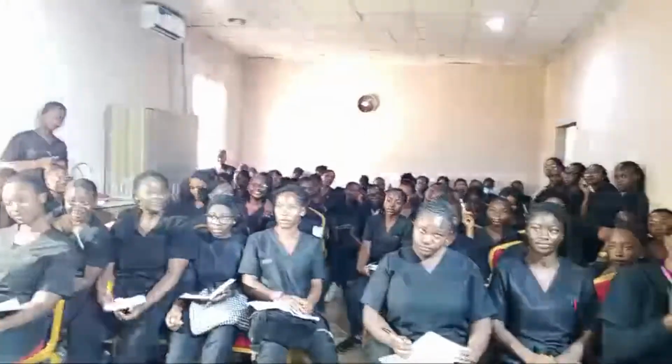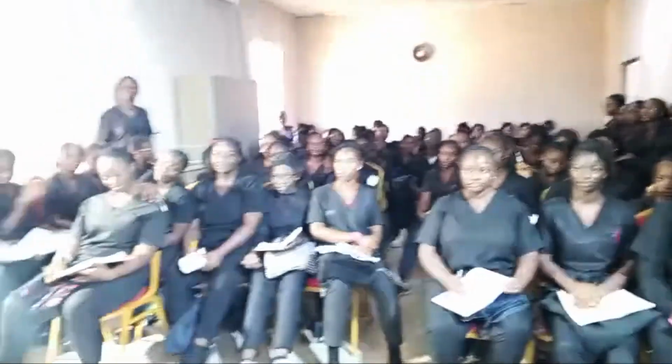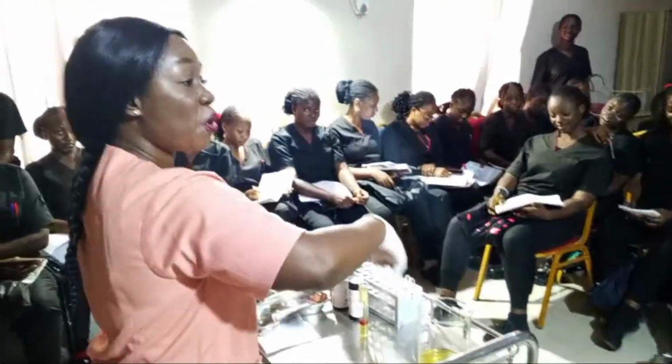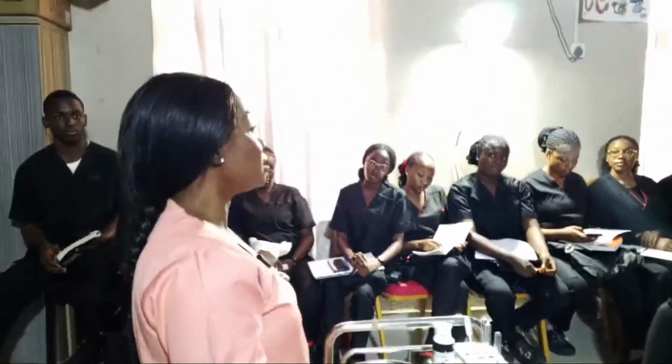Okay, the next thing is for us to perform physical examination, and physical examination consists of what? One person. If you know the answer, just raise your hand and tell me. You check the amount of the urine by physically seeing it with your eyes, whether there are particles, blood, big blood clots, whatever. Isn't that the next thing?